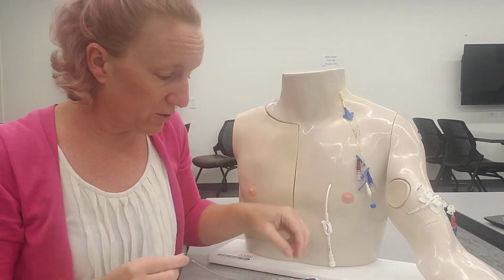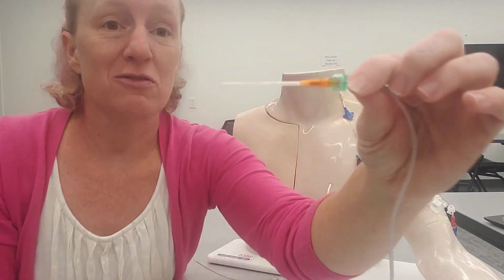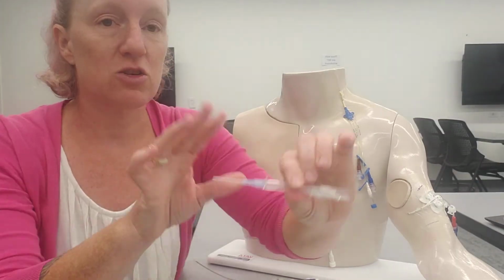When it comes to peripheral lines, there are different sizes. So it is always nice to be nice to your nurse, because she or he does pick the size of your catheter, Foley and IV. So this is a 14 gauge. This one, if you don't like me a whole lot, I'll know it, because this one's going to hurt when it goes in, versus this is a 22.